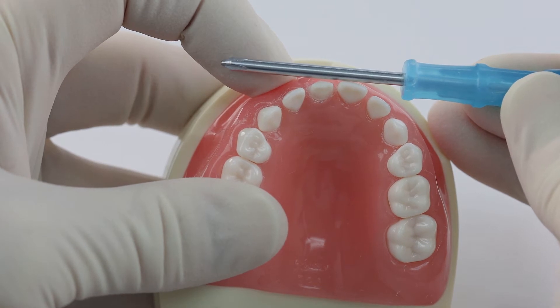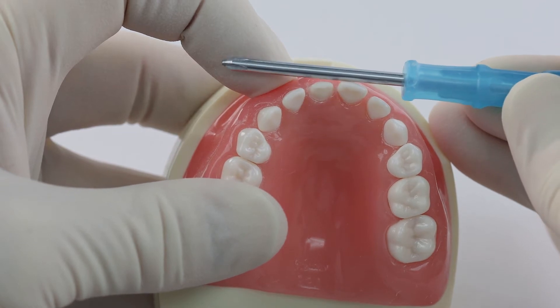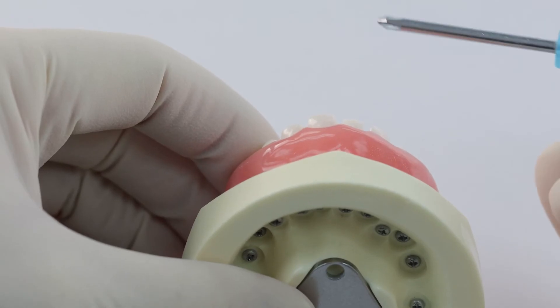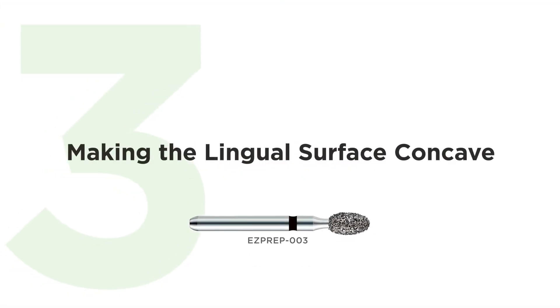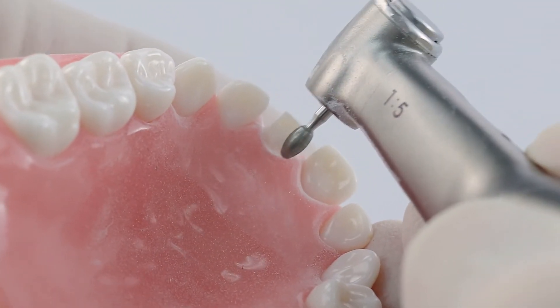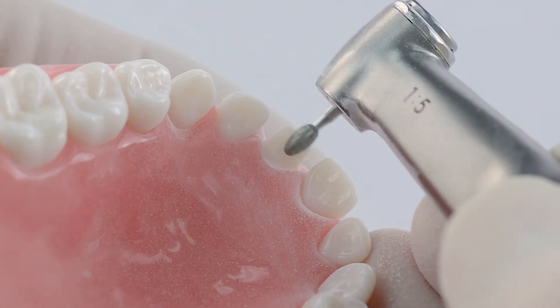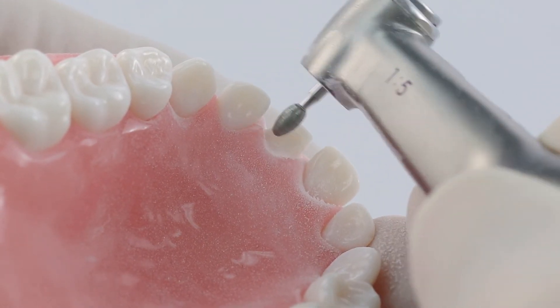When you're working on a patient, you can just take your explorer, probe, or any instrument and basically hold it there. You've got to go this direction — you can put the mirror here and then hold a straight edge here. You want to not only prep in the middle of the tooth to make it concave, but also carry that lingual reduction up to include the incisal edge.